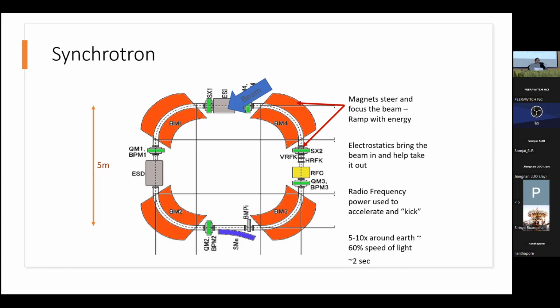The more you compact a synchrotron, the less physical space it takes up. The less physical space it takes up, the more space you have for other things, for treatment rooms, etc., and the lower the cost of the building. A disadvantage when you start to shrink it: one, the amount of particles it's able to actually hold decreases if you're not very careful.